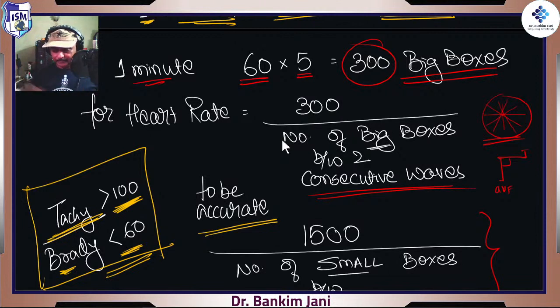It should be fixed in your mind what exactly I am doing. So when you will be doing it, draw this figure, this Cabrera system, right? What we saw over there, that Cabrera system. Draw it 10 times, draw it 50 times, until it is part of you. And then see how easy the rest of the diagnosis becomes. So tomorrow we will not take congenital heart diseases; that will be taken afterwards. Tomorrow we will take the second part of ECG.